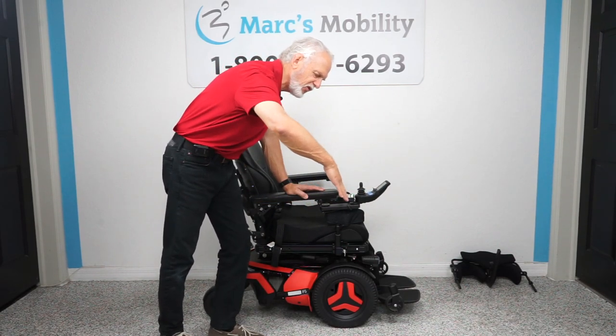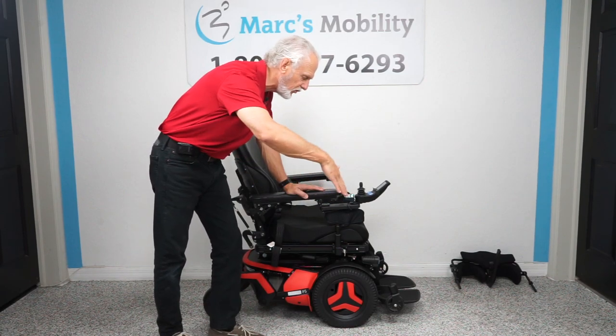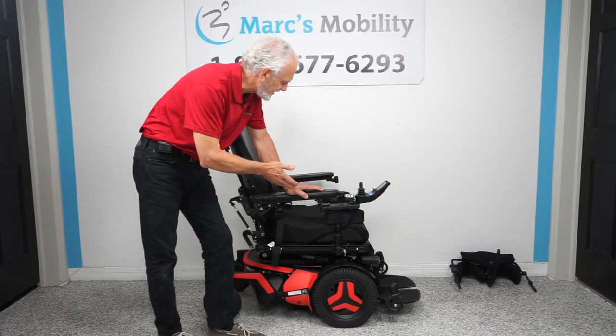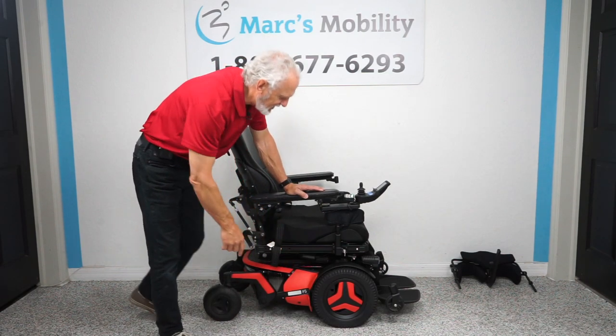You also have the vertical standing and the anterior tilt. Folks, there's nothing more they can put on a power chair — this is the most expensive power chair out there. It's the F5 VS.